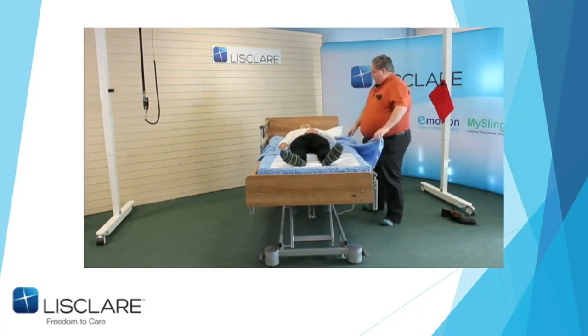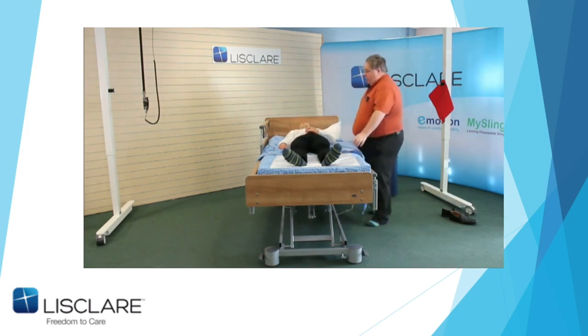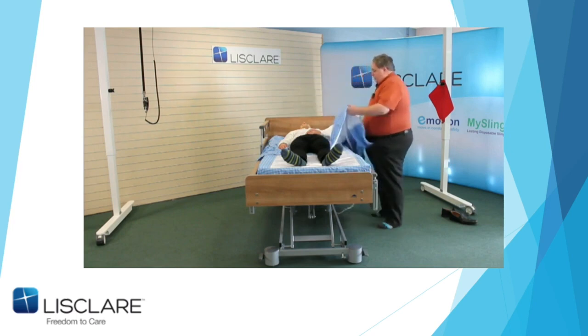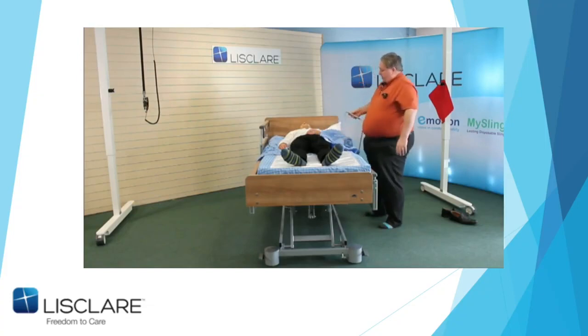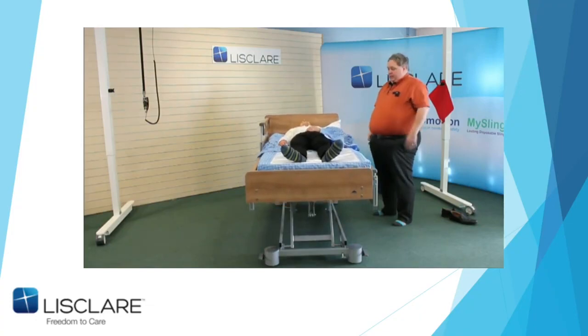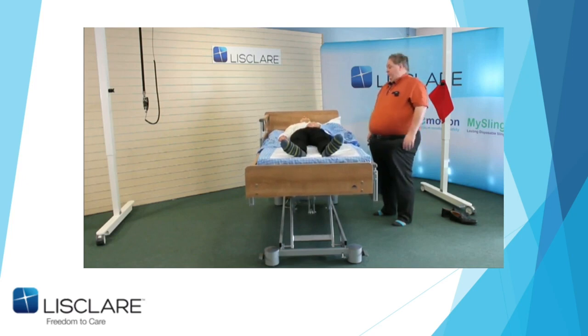So, to do another turn, just to show you, if this was a negative active patient, which could be dementia or whatever, the worst thing in the world to do with a dementia patient is to walk over and do that. Because if I came in at 2 o'clock in the morning and decided to do that to John, I know what would happen. So I'm just going to do the turn slightly different. I'm going to lift the bed up to full working height. John can't cross his legs, he can't lift his legs, and he's not going to help me in any form whatsoever. Kind of like my normal working day, John.